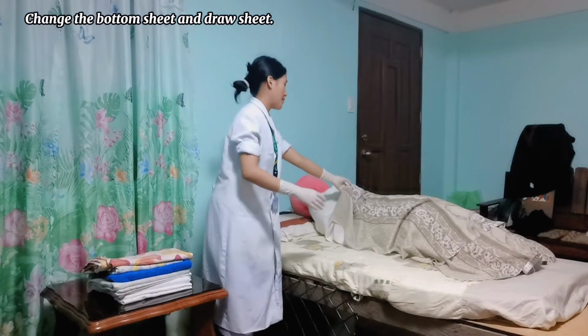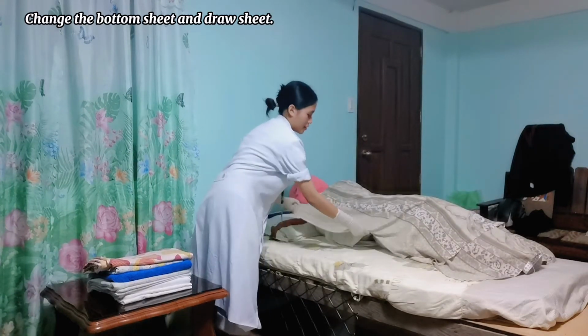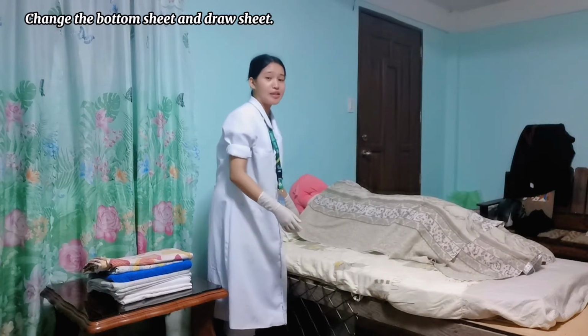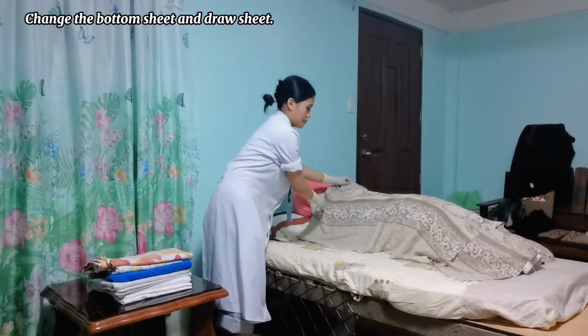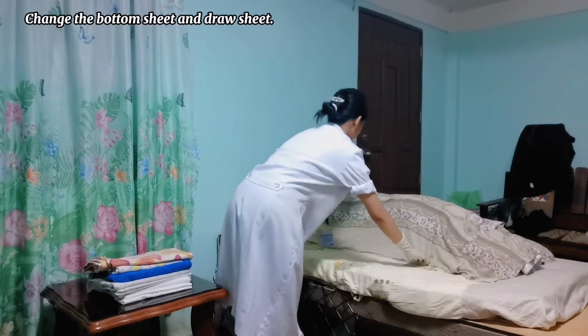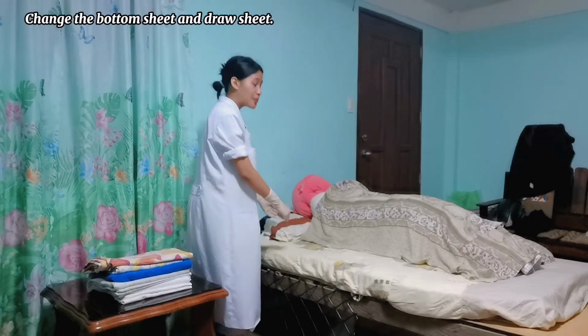Ensure the client's privacy and dignity. Make sure that the body of the patient is not exposed. And then we are also going to move the pillow.